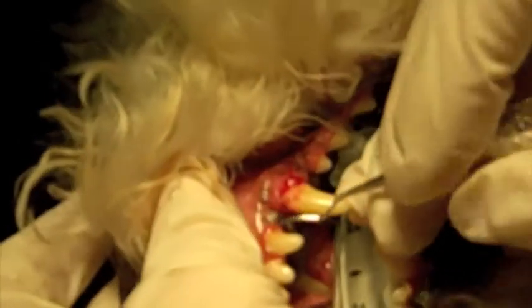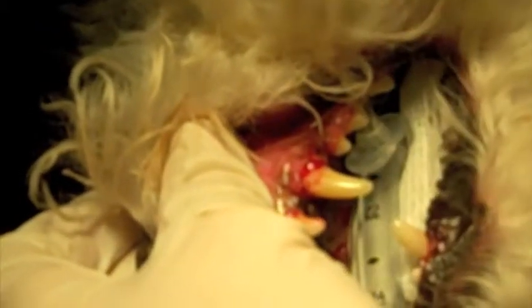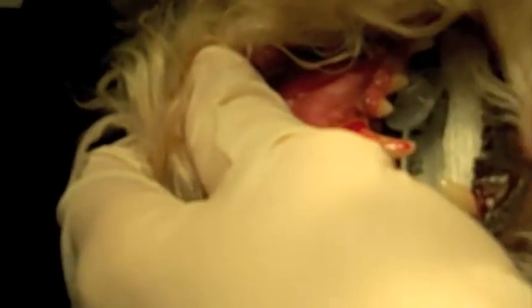So that's most of the larger chunks on this side of the teeth. And now we're going to use this tool to scrape under the gum line and over the tooth to get as much of the tartar as we can off, and then we'll follow up with ultrasonic scaling as well. And just like people that do not floss regularly, as we do the scaling, it's common for their gums to bleed a little bit. So they're not used to being probed.